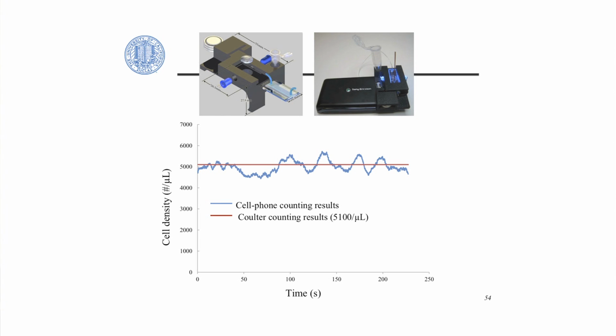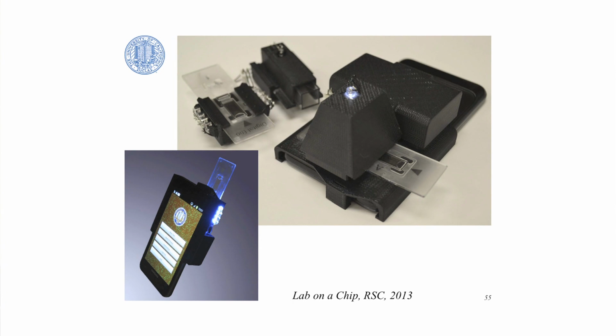And these are some different versions of the same design. Without any flow, using an Android application, you can not only capture these images, but process them and give a report right using the cell phone without any supercomputer of the field, and it reports essentially, in this case, red blood cells, white blood cells, and hemoglobin density all together.